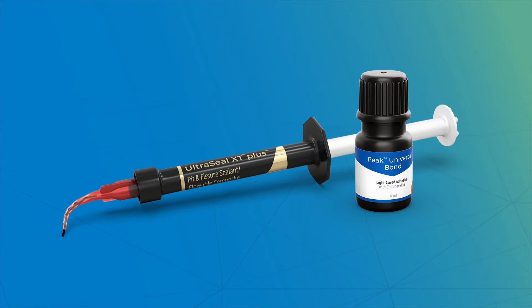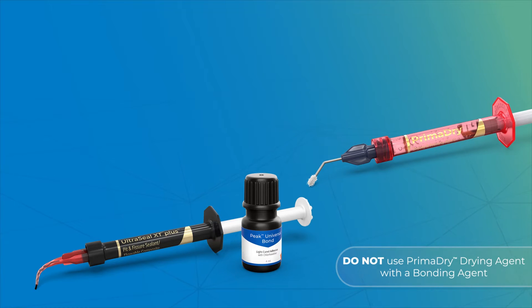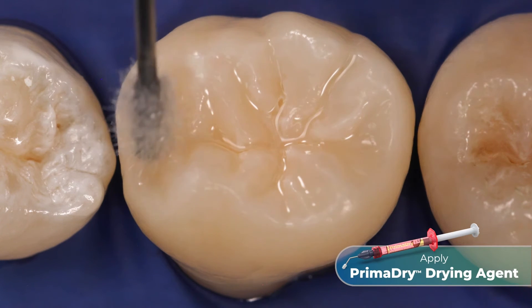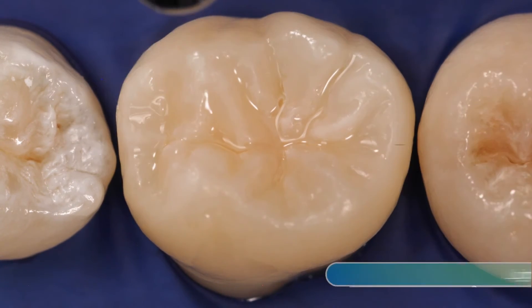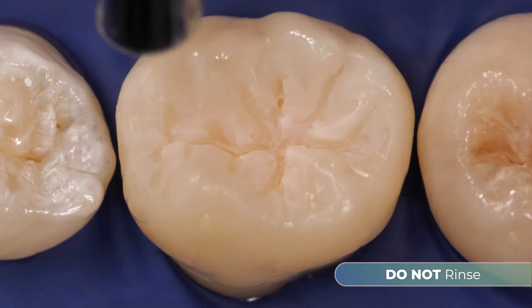Before you begin placement, it is important to note that if you are using a bond agent, do not use PrimaDry drying agent. Follow the manufacturer's bonding instructions. To place UltraSeal XT Plus Sealant, apply PrimaDry drying agent for 5 seconds, then air dry the occlusal surface. Do not rinse afterwards.